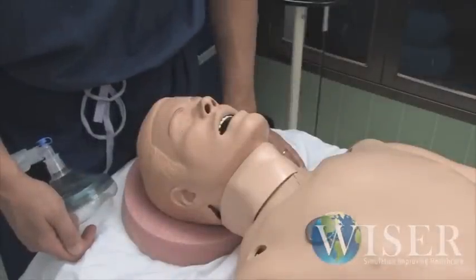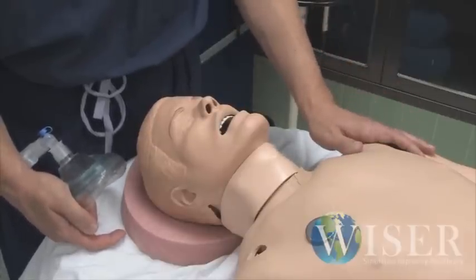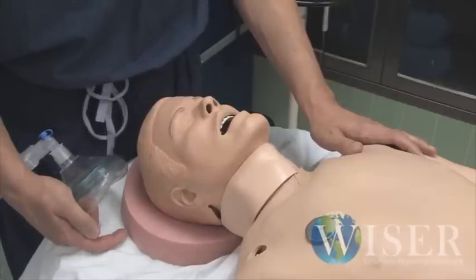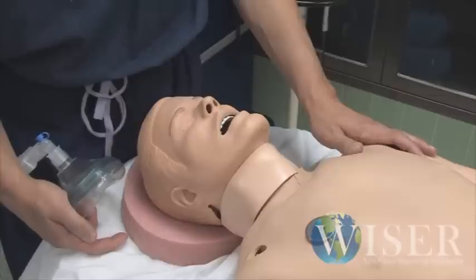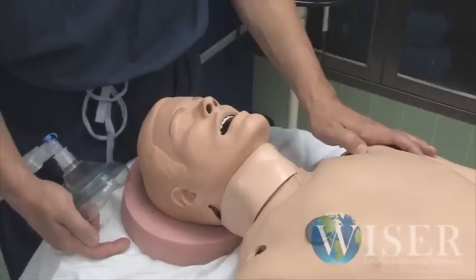There are some important idiosyncrasies you should know about the mannequin that affect how easily he is to ventilate. From his body size and habitus, he looks like a 70-kilo adult male, but his lungs are very, very stiff and non-compliant. We measured them once and they're one-third of normal lung compliance. So said another way, even though he looks like he's 70 kilos, functionally he's about 150 or 180 kilos. His lungs are very, very stiff.